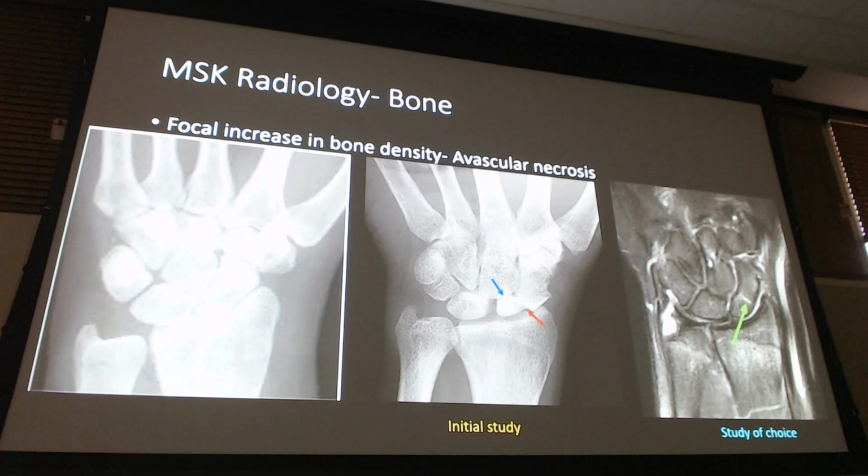They come back, I'm starting to see a little bit of a difference here. Now, I want you to look at how sclerotic, right here where the blue arrow is, see how much brighter white it is than the one on the left? If I gave you just this stage, as far as the sclerotic goes, maybe you'd miss it. But if you compared it to the other carpals, which is fair game, you'd be like, hey, maybe that looks a little bit different.